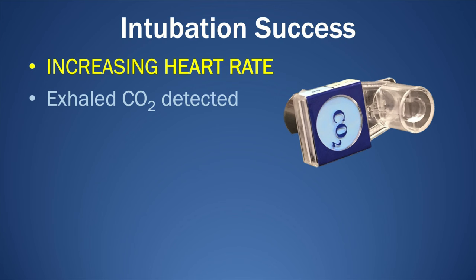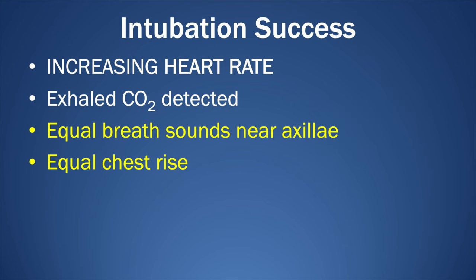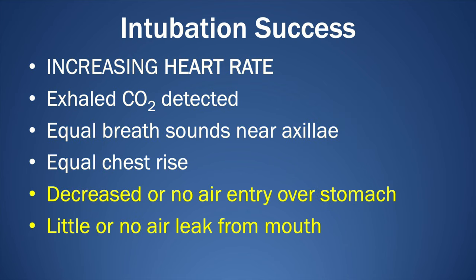The primary methods to confirm that the endotracheal tube is in the trachea is a rapidly increasing heart rate and the detection of exhaled carbon dioxide, CO2. Other signs will include equal breath sounds in both axilla and chest rise during PPV. There should be decreased or no entry over the stomach and little or no air leak from the mouth. No single sign is perfect, and you must use all these signs with good judgment to decide if you are successfully intubated.